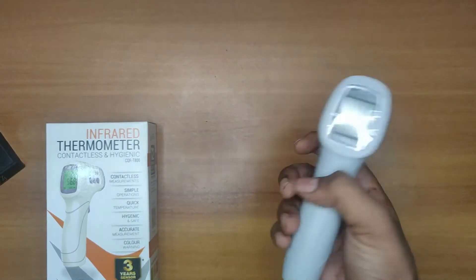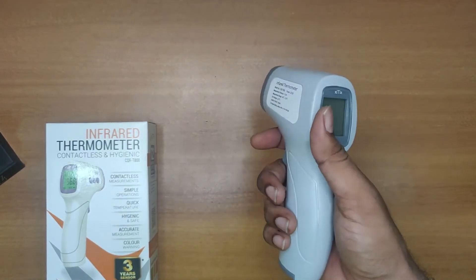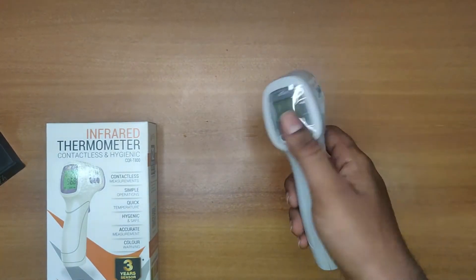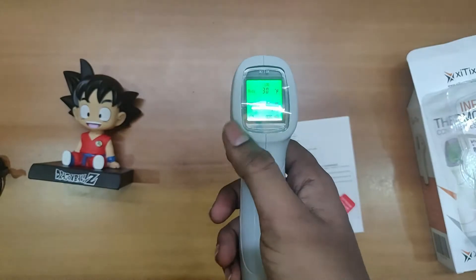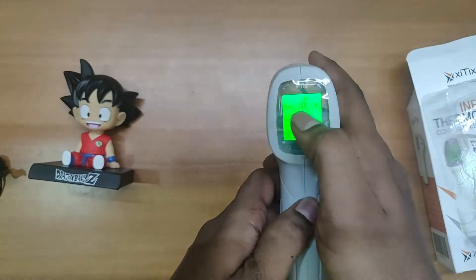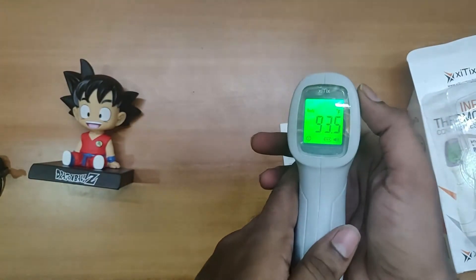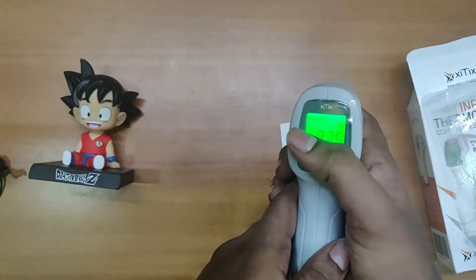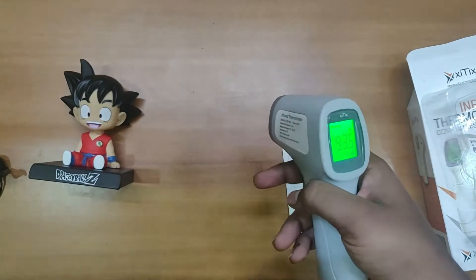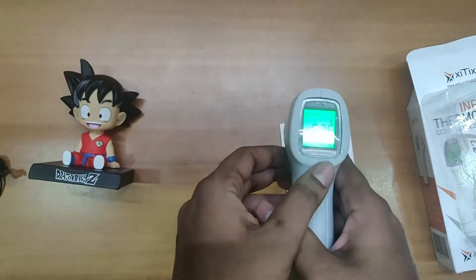Also, friends, it does not have any power on or power off button — if you don't use it, it automatically switches off. As you can see on the screen, there are two types of modes: body mode, and if you click on this, we can see the surface temperature mode, which you can also use for mobiles and laptops to check if they're overheating.